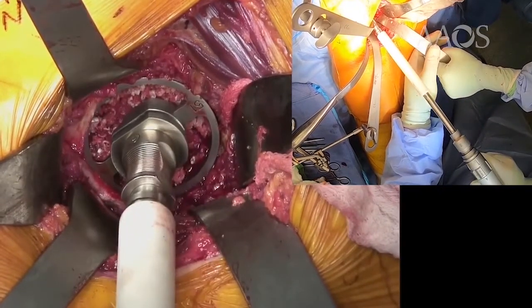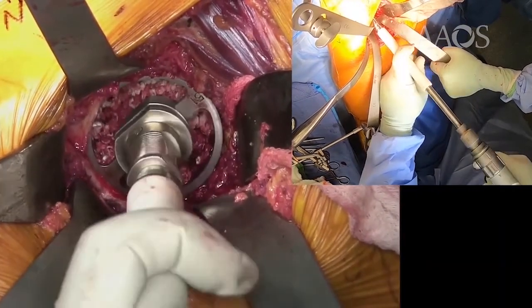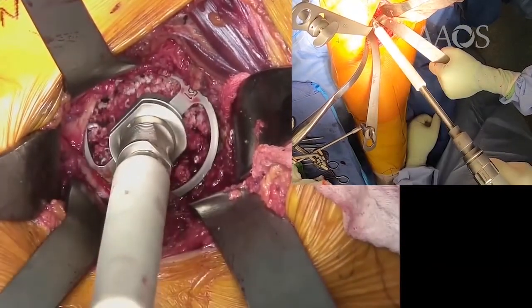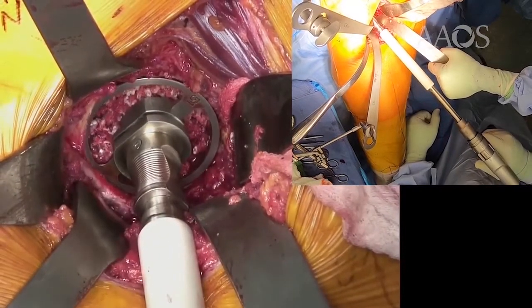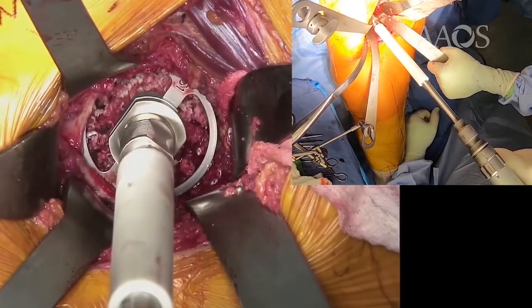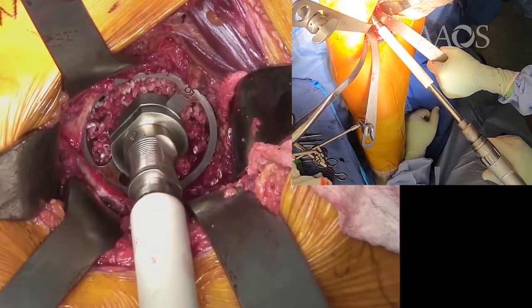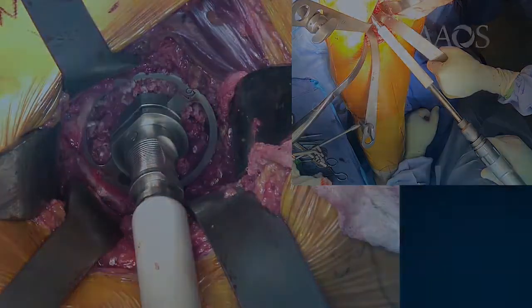For each reamer step, we utilize this technique to preserve the ligament and maintain our neutral anatomic position as we prepare the case. Here, it's demonstrated as a 45-degree angle.